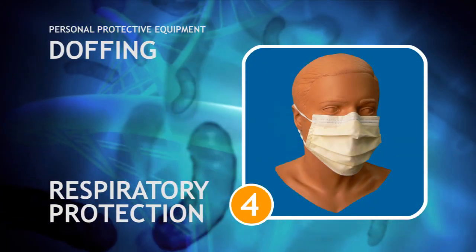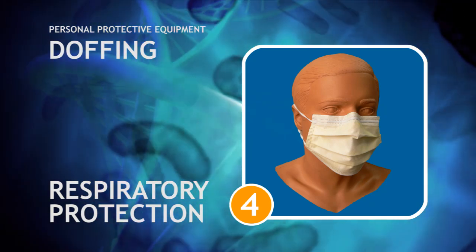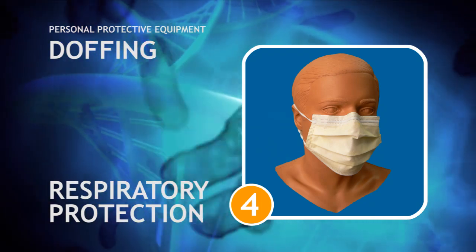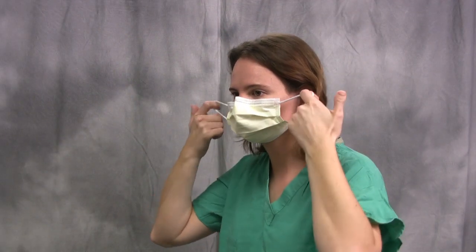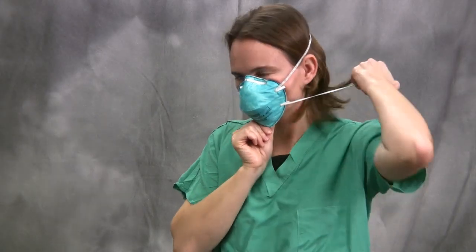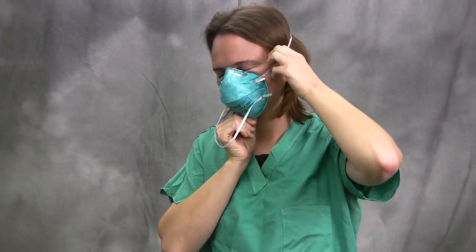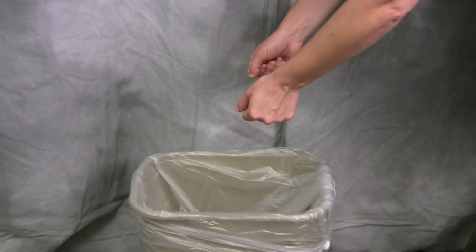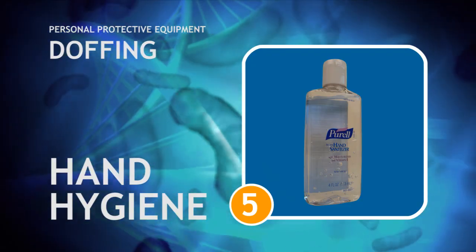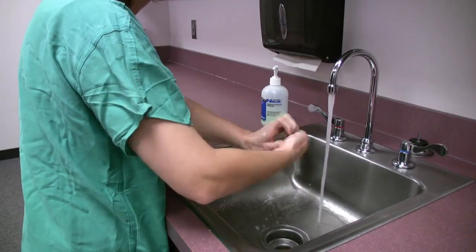The fourth step is the removal of respiratory protection. It is removed last to prevent any transmission of contaminated particles to your respiratory tract while removing the other equipment. Touching the front of the mask or respirator should be minimized during removal. When a mask or respirator has two elastic bands, remove the bottom one first, then discard the mask in the trash. Finally, perform good hand hygiene immediately after removing all of your personal protective equipment.